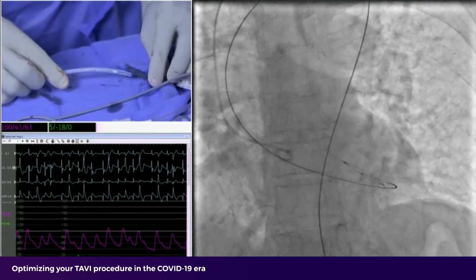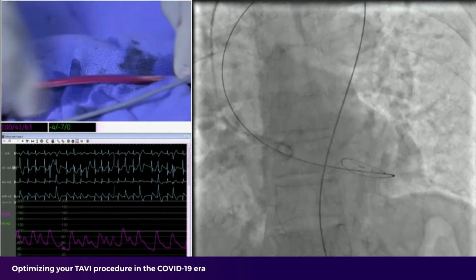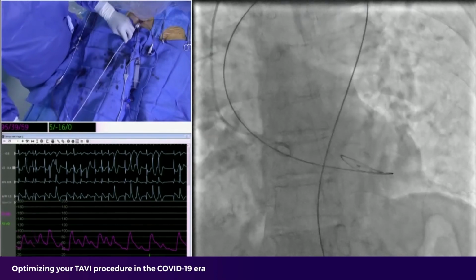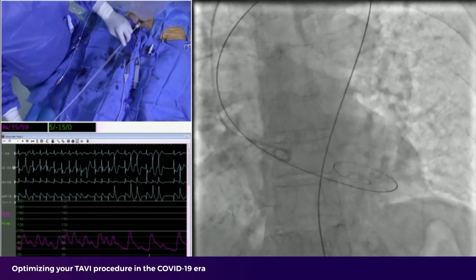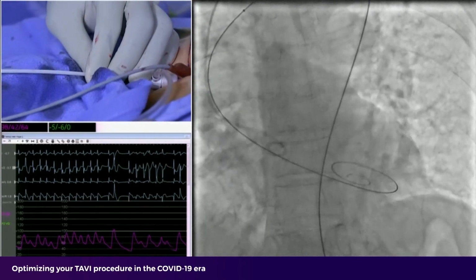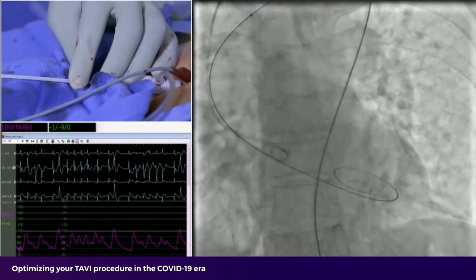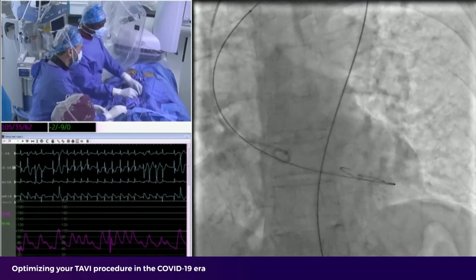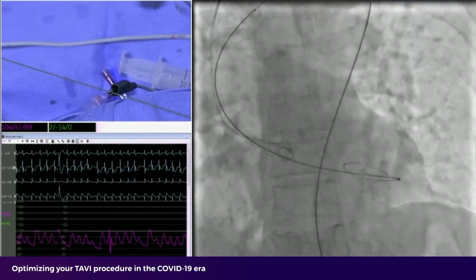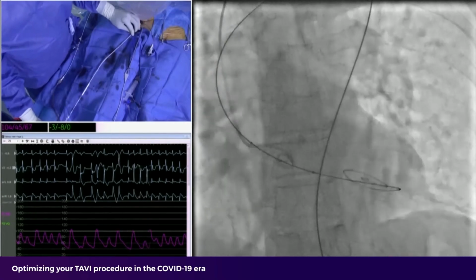Usually we tend to remain on the safe side for predilatation, using the minor axis of the annulus at baseline, just to open up the leaflets a little bit and avoid being too aggressive before device implantation. But here, given the amount of calcium, and given that we want the device to fully expand once put across the aortic valve, it's going to be more towards a 0.9 ratio, just to be a little more aggressive for this particular patient. But usually, we go for a more gentle predilatation.